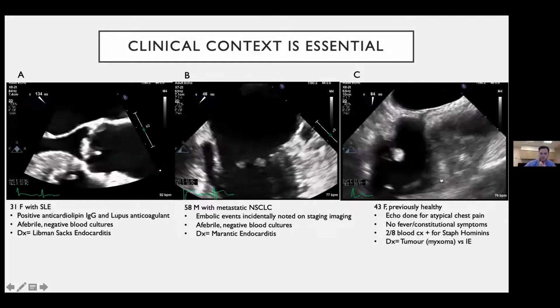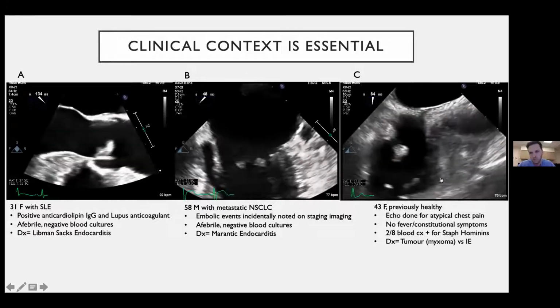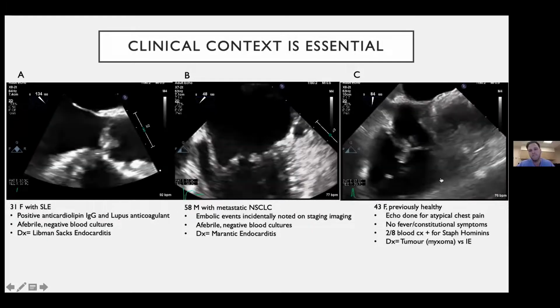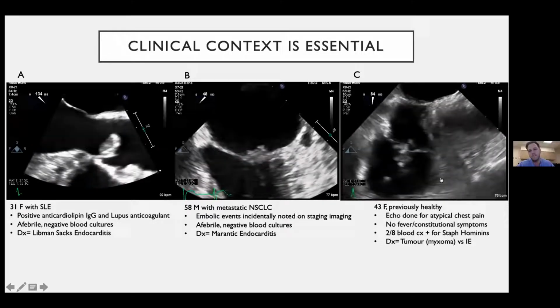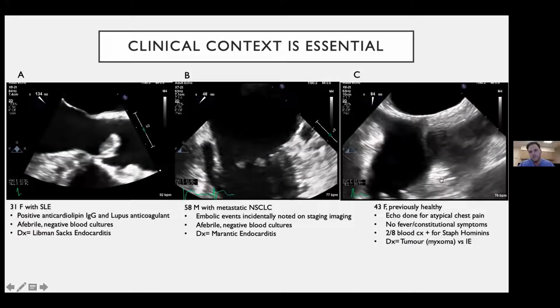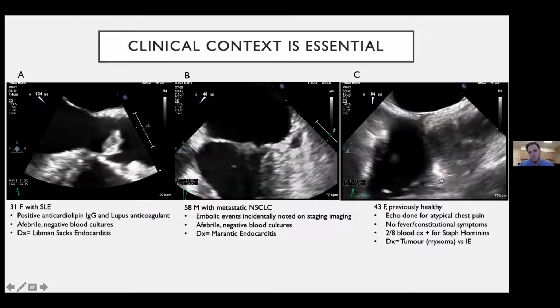So Mike, I wonder if you can tell me again, like you said kind of a bit broad-based, kind of radial appearance. Like what's the appearance? Like if you see one thing, what is the thing that points you towards endocarditis versus not? Like you talk a little bit about the clinical story, but if you just look at it without any story, is there some feature that you say, oh yeah, this is for sure endocarditis versus not?